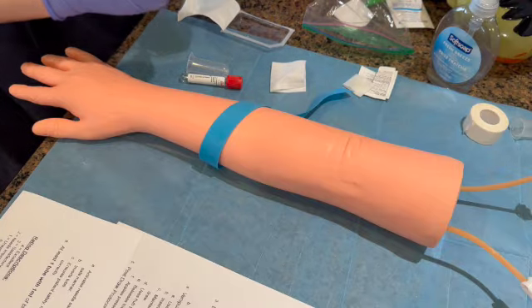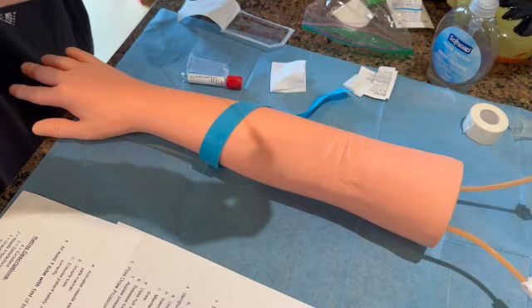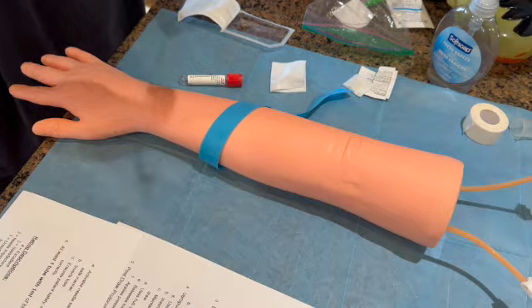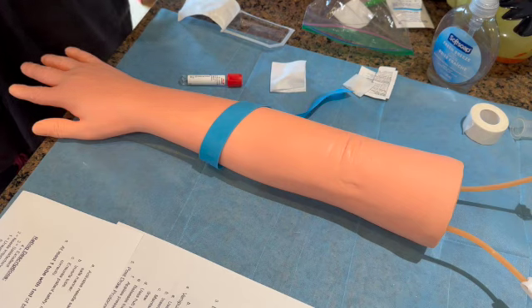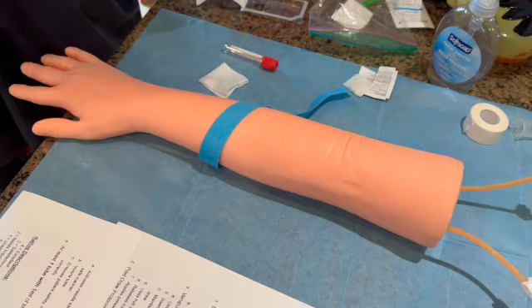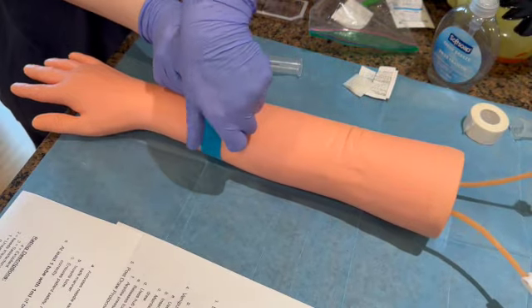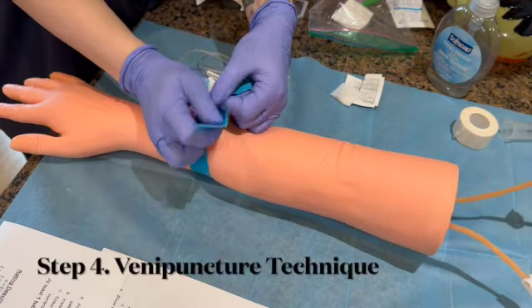So we're going to set that down, and I'm going to prepare my tubing. I'm also going to make sure that everything is set up and ready to go here for Robert. This looks nice and straight. And same thing, I'm wanting to make sure that all of my equipment is set up on the non-dominant hand side for this draw. Robert's hand looks ready to go. So as we maintain sterile technique, we're going to move on to step 4, the venipuncture technique.